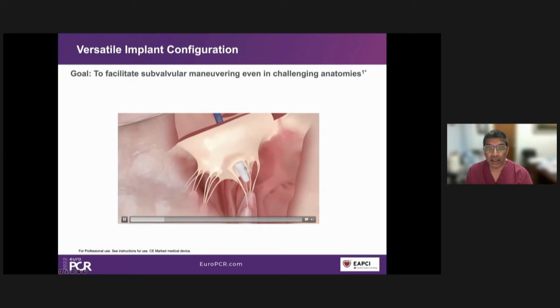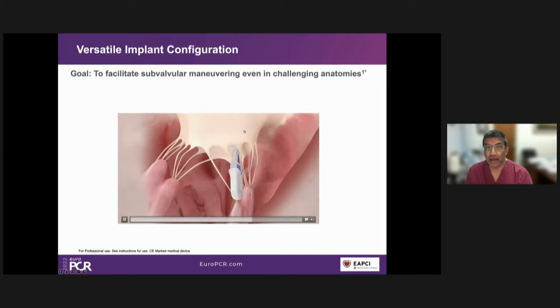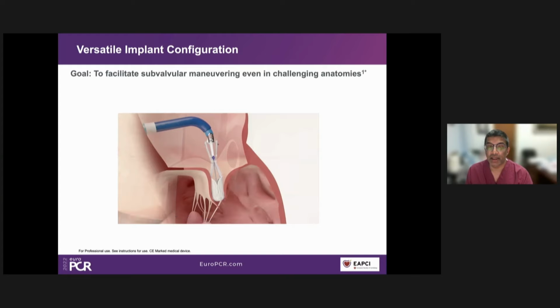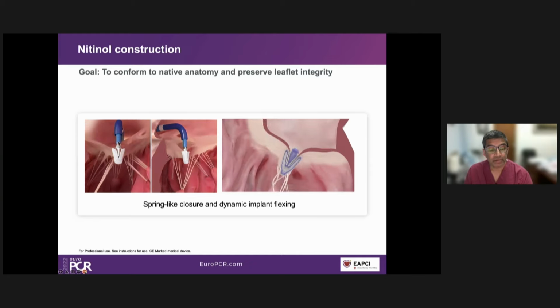And this is an example, this is obviously not quite as medial, but say you don't like the position or you're stuck in cords. As you elongate, the retention elements are up top. And as you're withdrawing, the retention elements are not in the direction of tissue. So even if they're engaged in the valve, it should allow you to come out of situations where you're stuck. And this is that concept of getting more valve area because there is some motion with the nitinol elements in diastole. And you can see that in these animations.